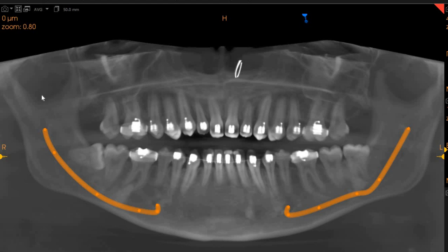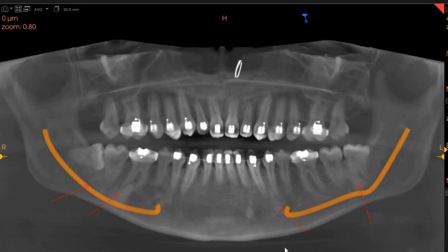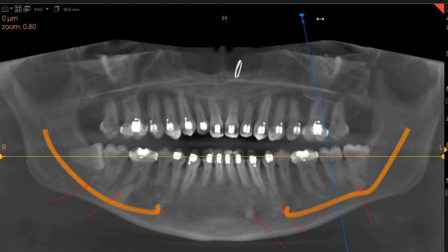On the panoramic view you can very clearly see we have quite a few radioopaque lesions right here and here. These radioopaque lesions are not associated with radiolucencies but are hyperdense areas where there is very significant radioopacity, and hence we can observe these lesions.